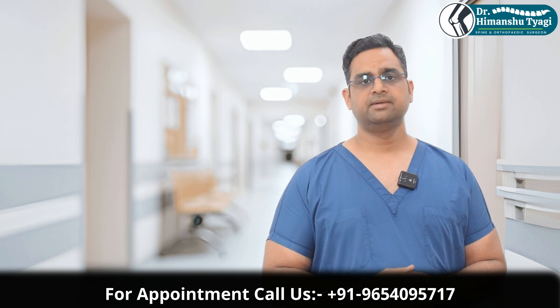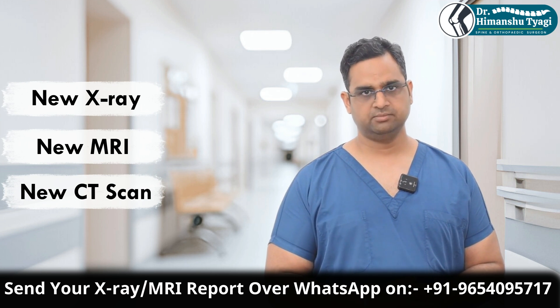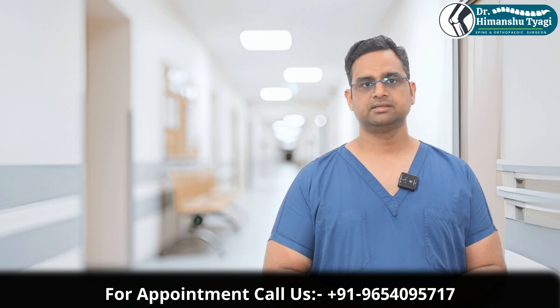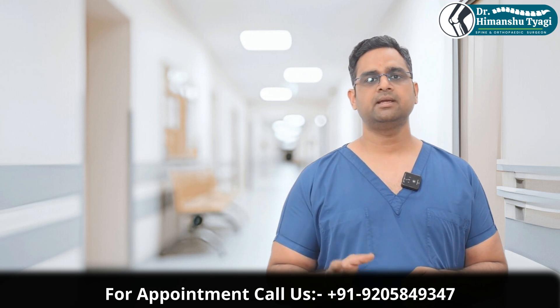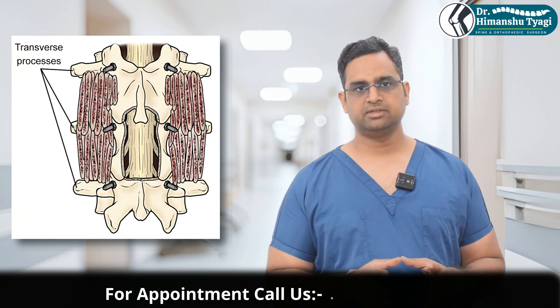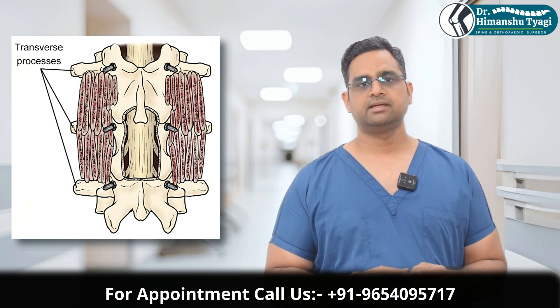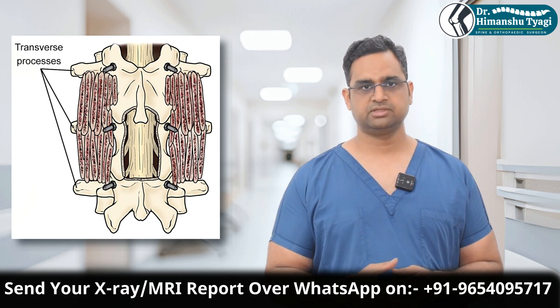Whenever we plan for a revision spine surgery for implant failure, the first thing is we investigate the patient thoroughly. We get a new x-ray, new MRI, and new CT scan done to see what has actually happened. Once we know the reason, we take the decision of going ahead with the revision surgery, in which normally we replace the broken implants and focus more on fusion. If required, we take additional bone from other bones like the iliac crest or the tibia and put that bone in the spine so that fusion — the bone formation — happens. Once the bone formation happens, the implants are offloaded, meaning the pressure comes off from the implants so that in future there is no implant failure.